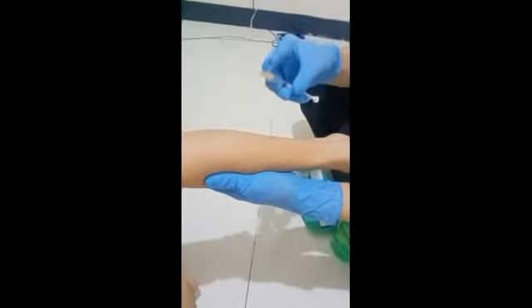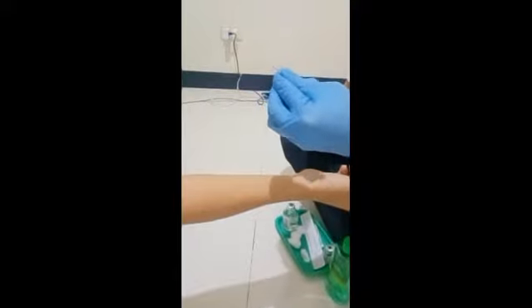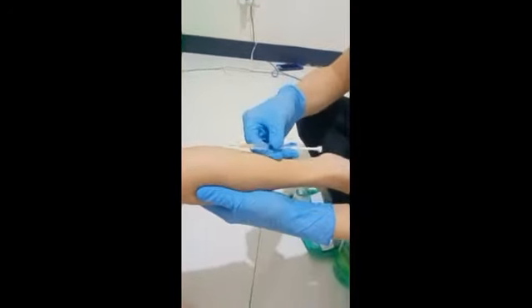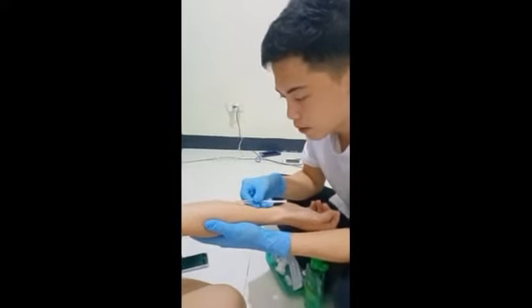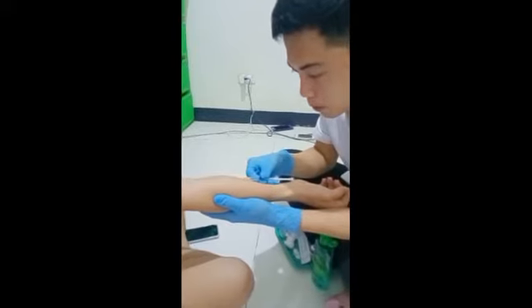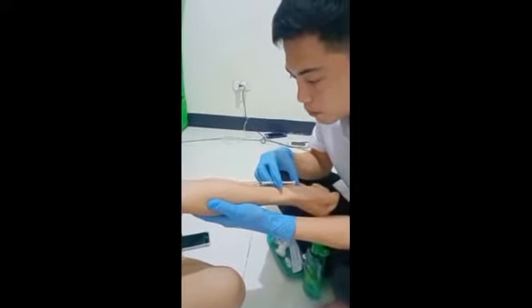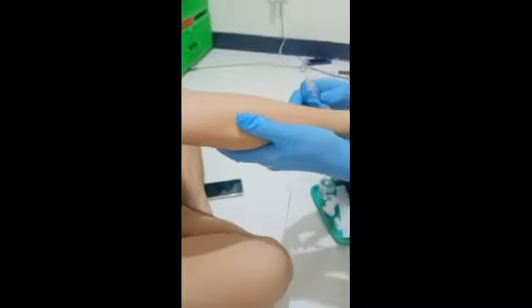And you need to place the bevel up for the skin test. So this is the injection for the skin test.